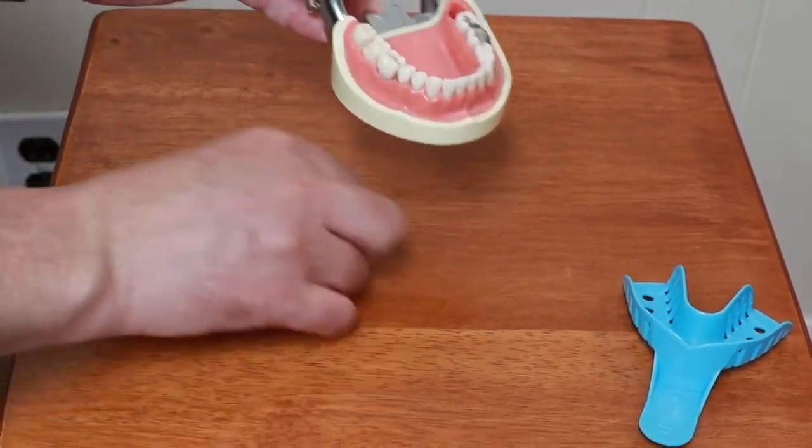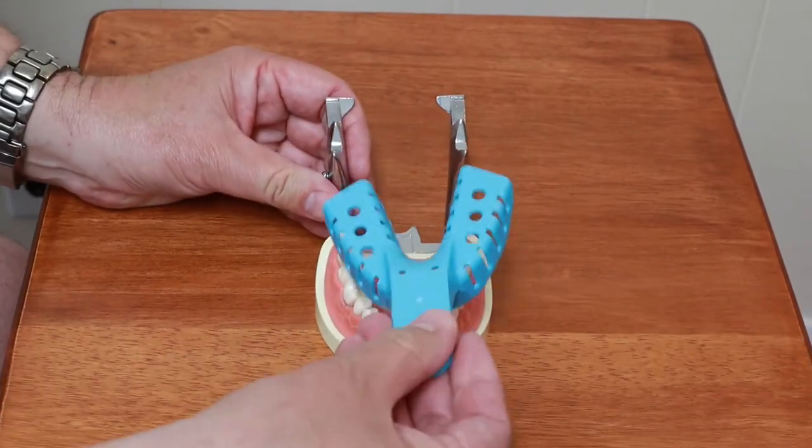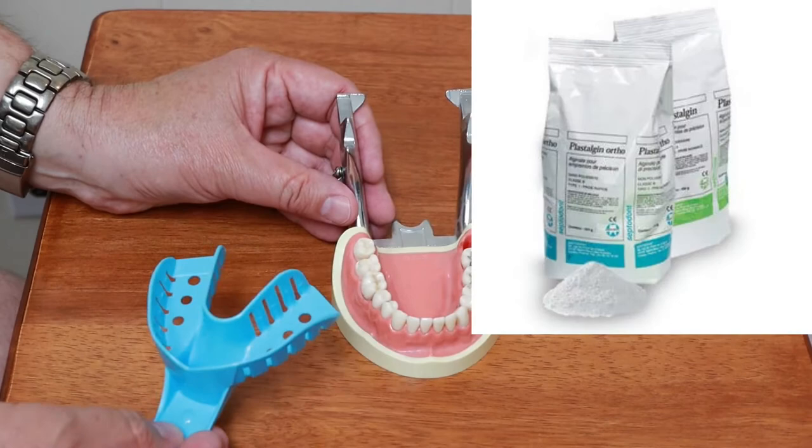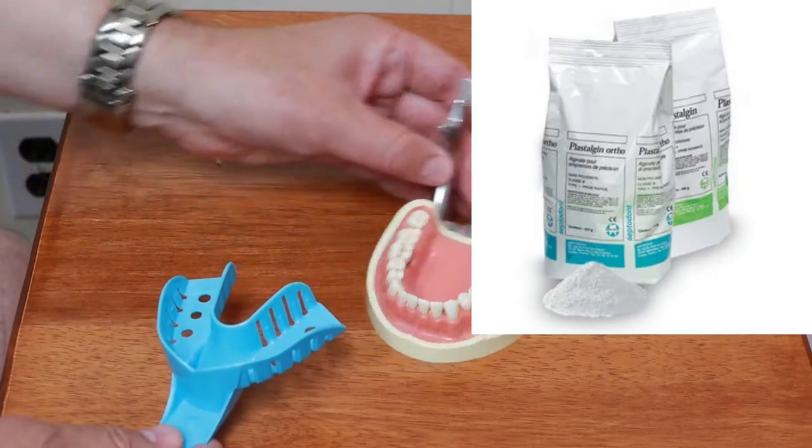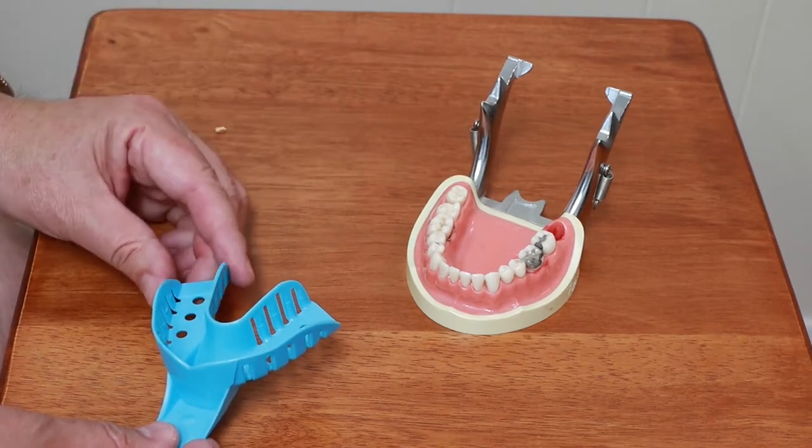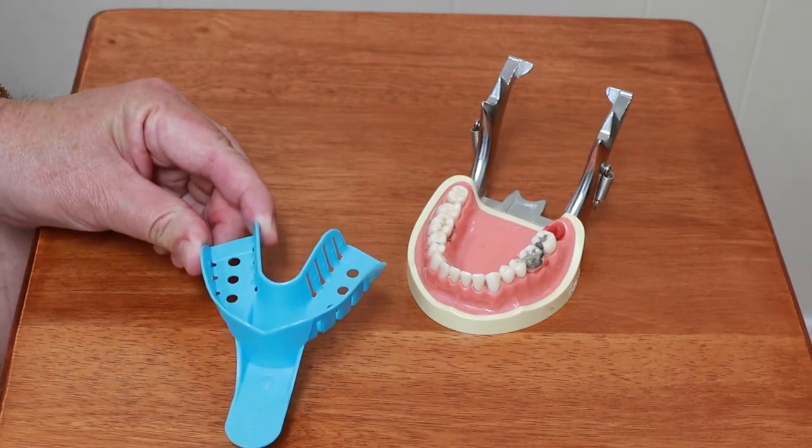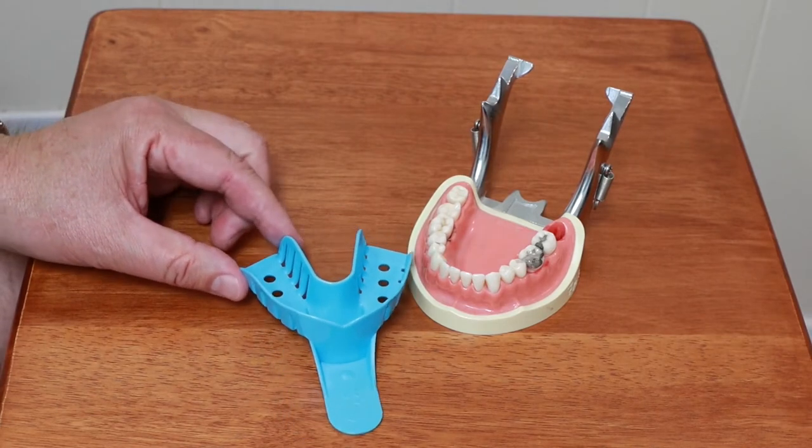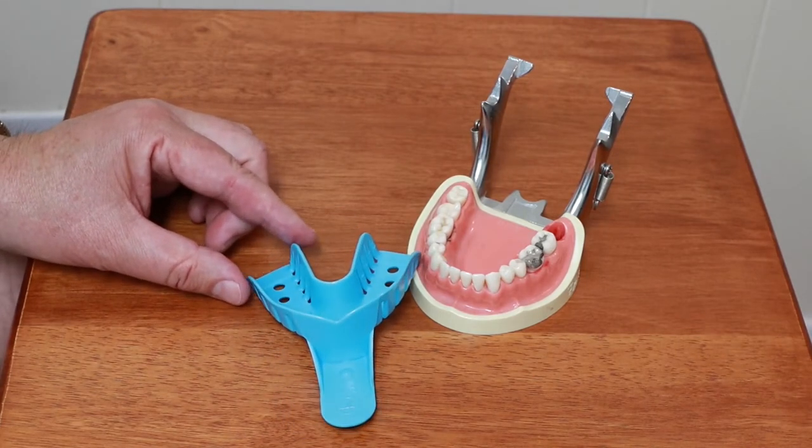Again I'm going to use a stock tray and this time I'm going to use a material called alginate. It's just for the opposing model. It's not quite as accurate as the VPS material but it's accurate enough for an opposing model. Let me go mix that up next.